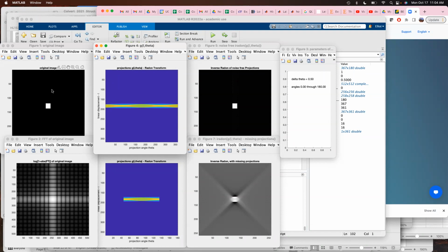If I'm integrating projections down this way, they're all going to be the same, except where they're 0. And then if we look at 45 degrees, we're going to get a peak right here. That's when we hit the diagonal, which is the maximum integral that we can achieve, so our raw data will have a peak there. And then as we rotate, it'll go back to a very uniform, or rectangle, function. So, any questions about that? That's G(L, theta). We're going to continue on with discussing this whole process.